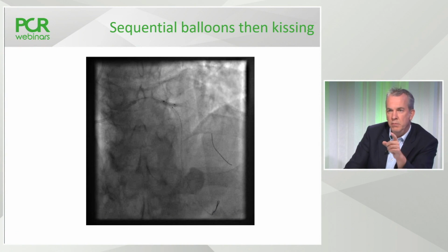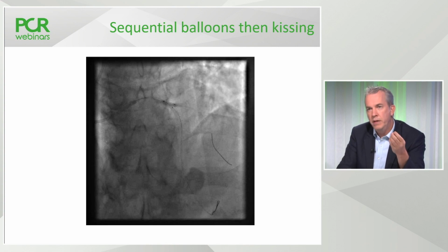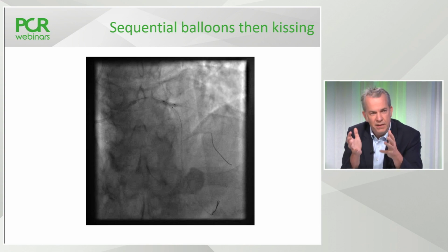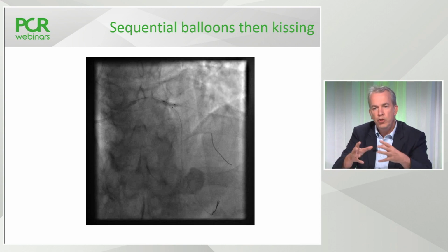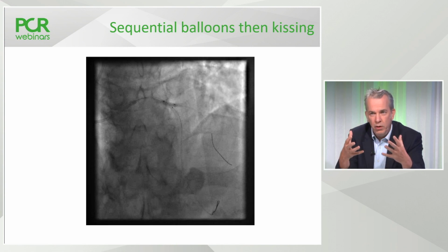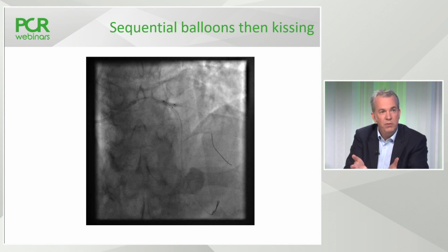Yes. You do a very important step, and I think it is mandatory for two-stent techniques: kissing. I agree. I think this is important in the two-stent techniques to do, I suppose aggressive is the wrong word, but a very determined kissing technique. And that means that each individual ostium of the bifurcation should be dilated to the correct size with a balloon that will make sure that you have really opened the ostium to a circular level.